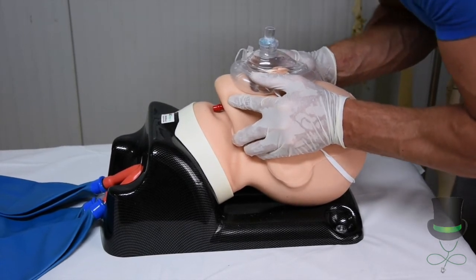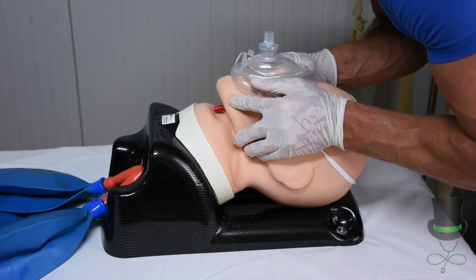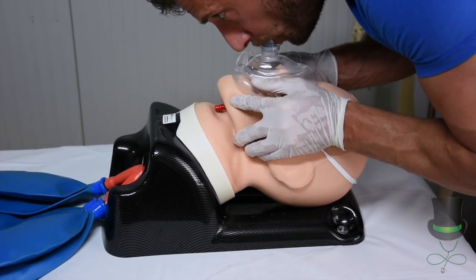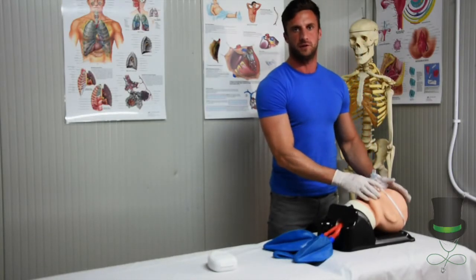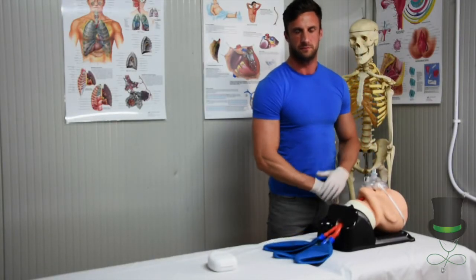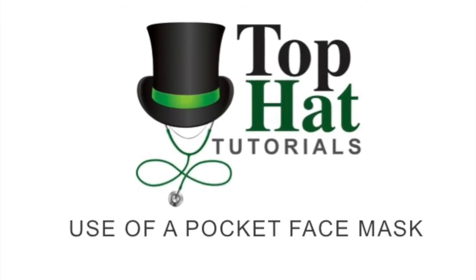And provide your ventilations, ensuring you look for the rise and fall of the chest.